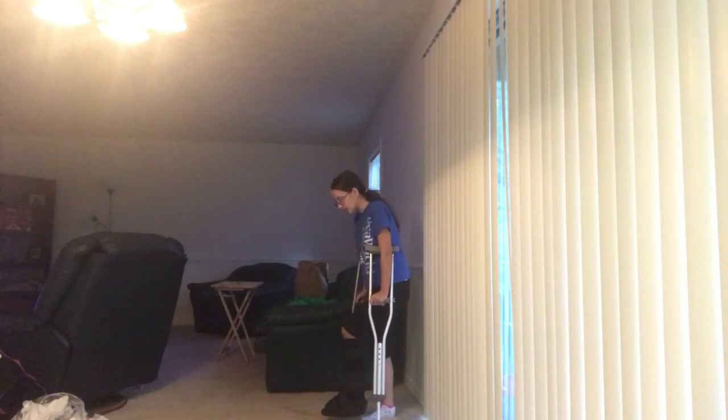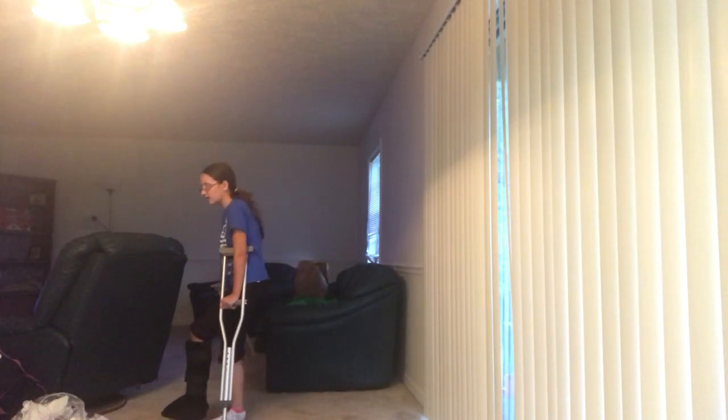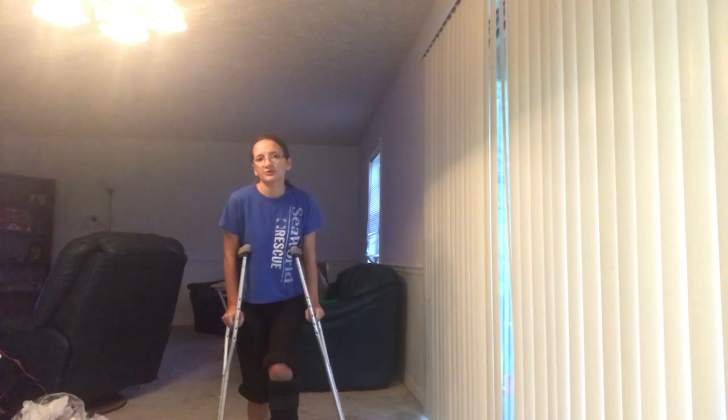But then when you start getting more confident with your crutches, you can move them and step through them, and that will give you a faster walking pace and it'll help get wherever you want to go faster. But when you first get your crutches, I recommend just stepping with them and into them rather than through them, and then when you get more confident.